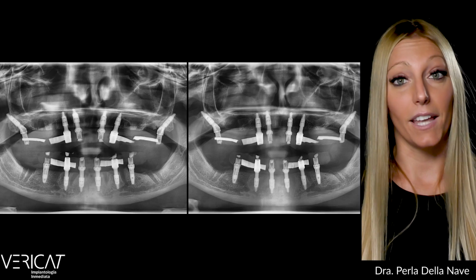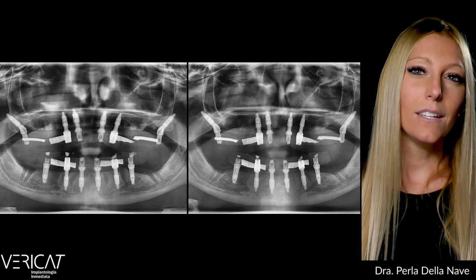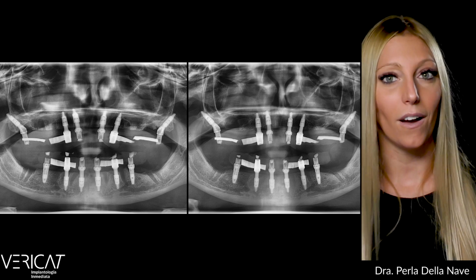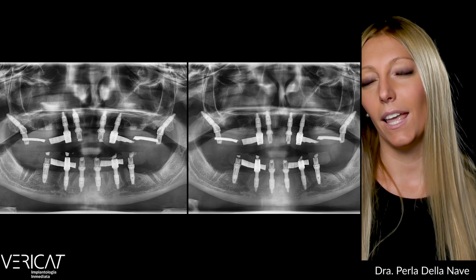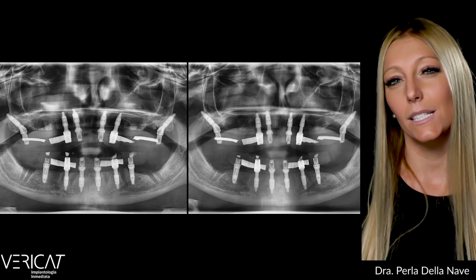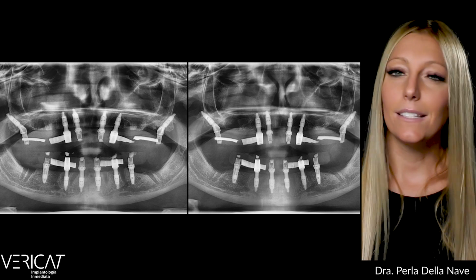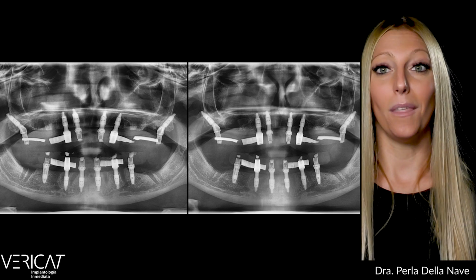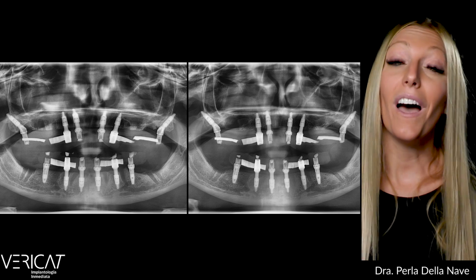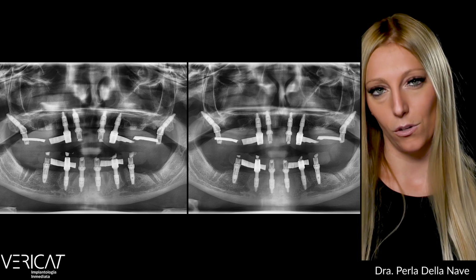The same can be said of this other case, where we highlight the presence in the jaw of 2 previously placed distal implants that give us the opportunity to observe the different depth, the different concept, and the different image they provide. So personally, I think this image confers less security in a long-term perspective, and also note that the 4 anterior-inferior implants are 9 millimeters long, so despite the abundant bone availability, because we think it's not necessary to place the longest and widest implants the bone can anatomically admit. On the contrary, we do prefer a shorter but deeper implant with a higher transepithelial component, and this is another of our distinctive signs, and you will also see it in other radiographs.